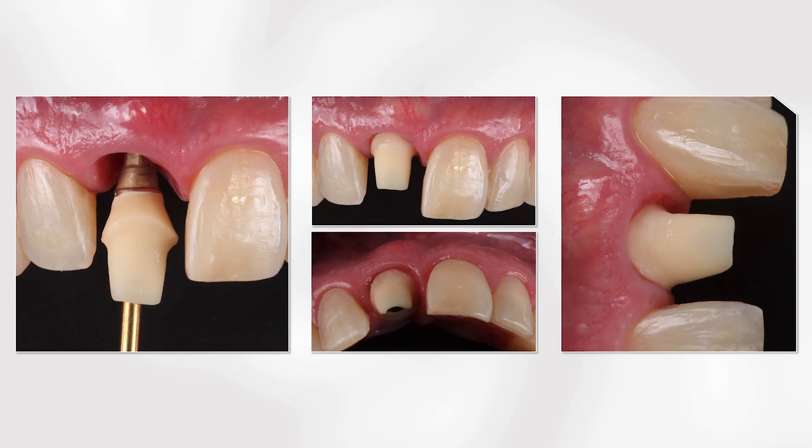The impression was taken, a customized ceramic abutment was made, and take a look at the correct ideal emergence profile of this final abutment. We left a slight concavity not only at the buccal aspect, but especially in the proximal areas to promote the papillae accommodation. The finishing line of this abutment was left half a millimeter below the gingival margin.